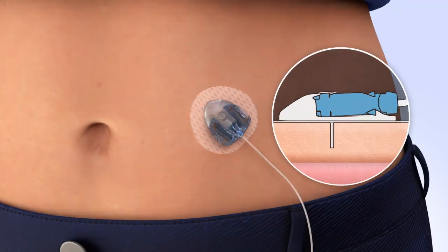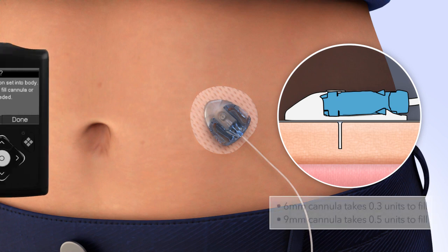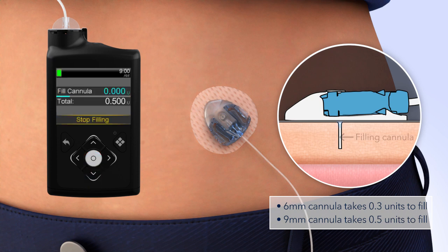Now that the introducer needle is removed, the cannula is empty and will need to be filled with insulin. On your pump, select Fill. The Fill Cannula screen will appear with either dashes or the amount you previously used. The amount needed to fill the cannula depends on the length of cannula you are using. To change the fill amount, press Select and use the arrows to scroll to the amount needed and press Select again. If the amount is correct, press Down to Fill Now. Press Select. The home screen will display the insulin as it fills the cannula.